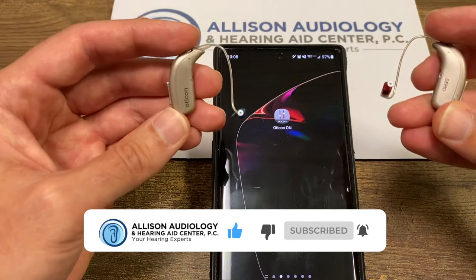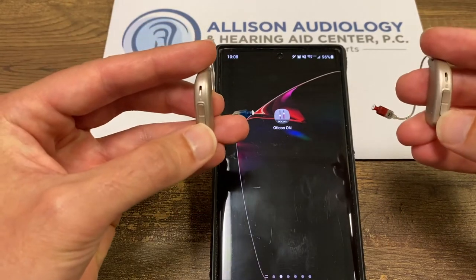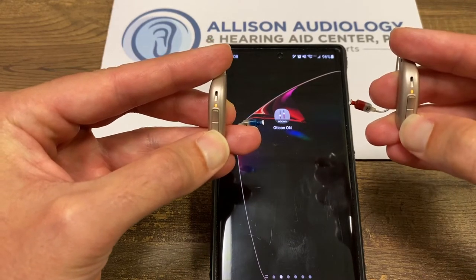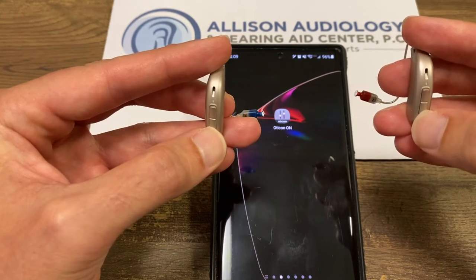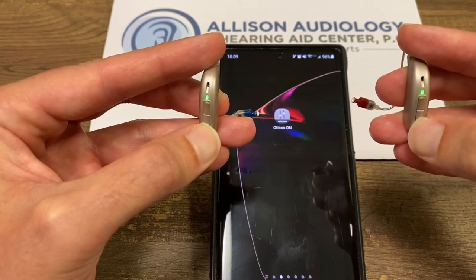The new Oticon hearing aids are rechargeable, so you would turn them on by holding the bottom button for about five seconds. Yellow light means they're off. Hold it again for about five seconds and the green light means they're on.